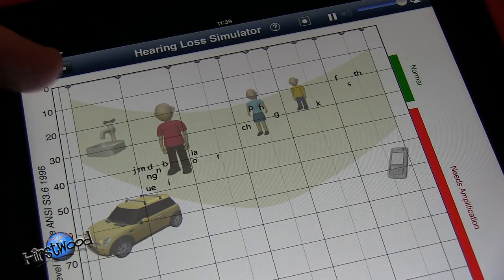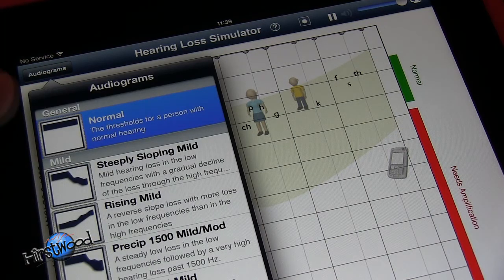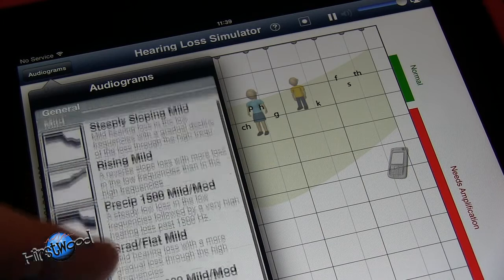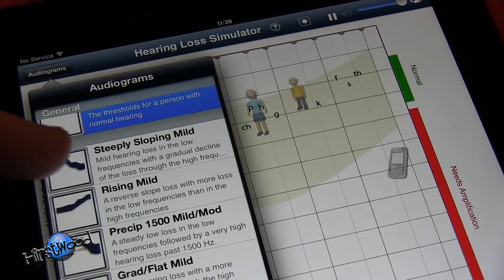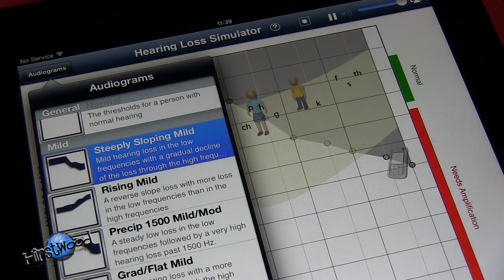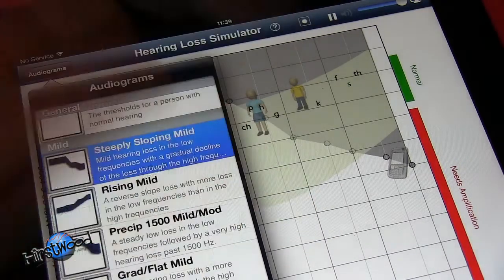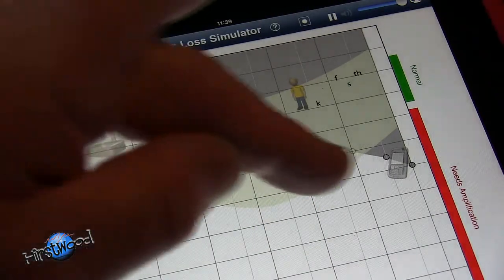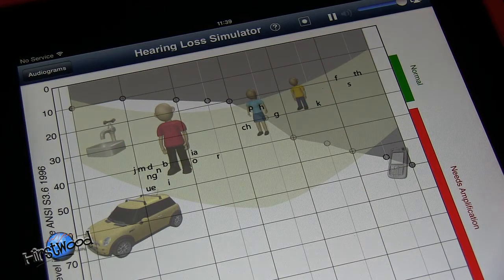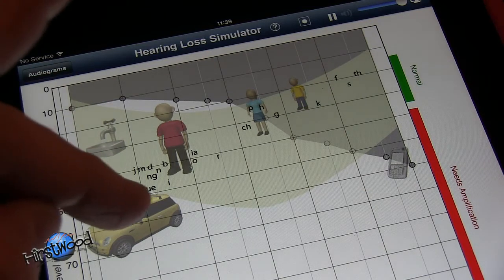That's what it sounds like normally. Go back to audiograms and let's go for a different kind of hearing loss - steeply sloping mild. Now press that, tap out, and you can see the graph here shows you from high frequency to low frequency what it sounds like. Let's have a listen.